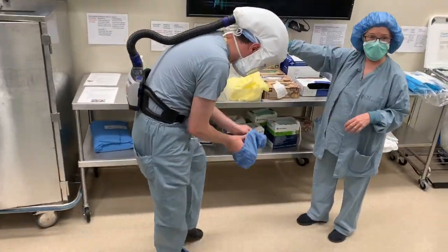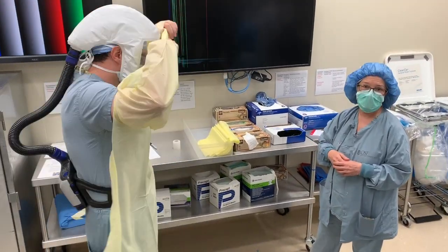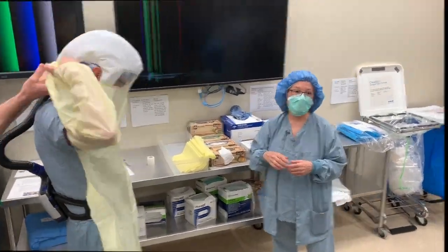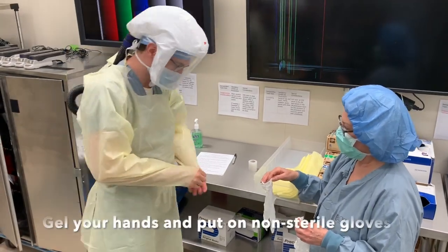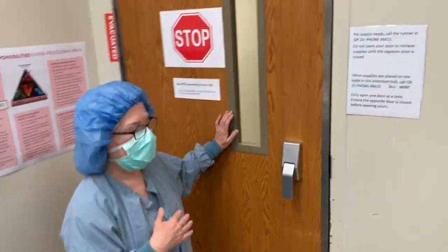You put shoe covers on even if you have designated shoes for the OR, and you put on a non-sterile gown even if you are going to be scrubbing later. You need to gel at this point and put on clean, non-sterile gloves.